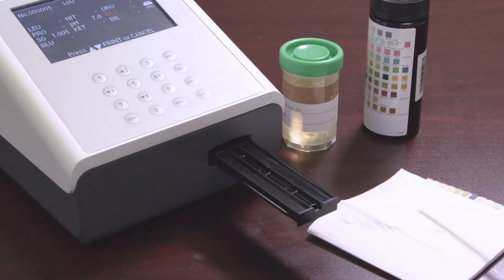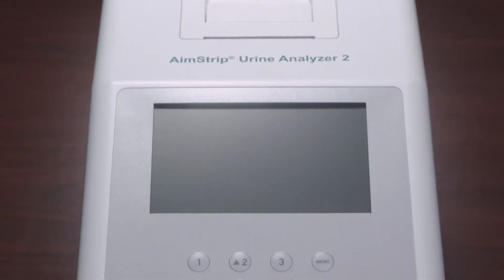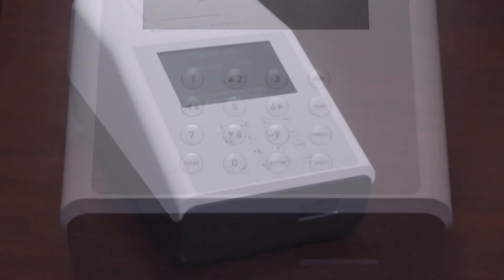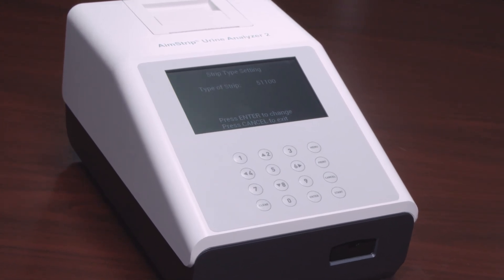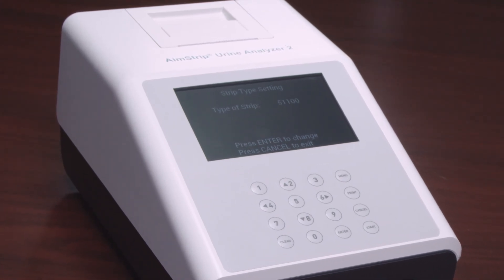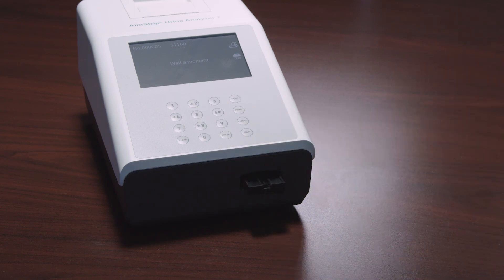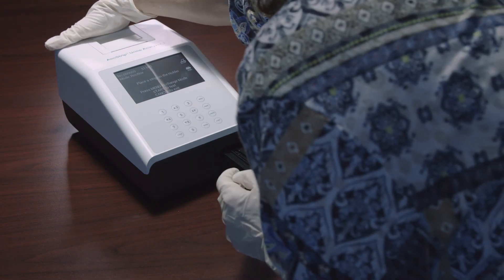It is important to always keep the analyzer clean. Keep the surface of the instrument free of dust at all times. If needed, external surfaces may be cleaned using a damp cloth. Do not use any solvent, oil, grease, silicone spray, or lubrication on any part of the instrument. For daily cleaning, remove the strip holder by pressing Start to fully extend the strip holder mount, then turn off the power switch after the strip holder mount is fully extended.